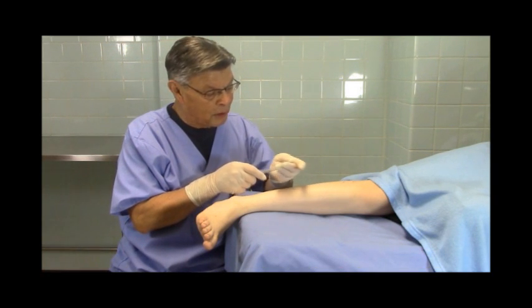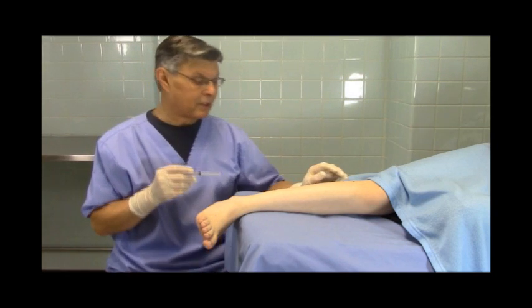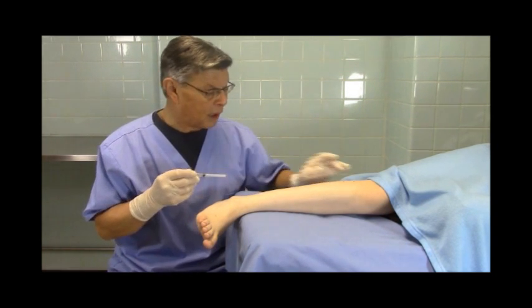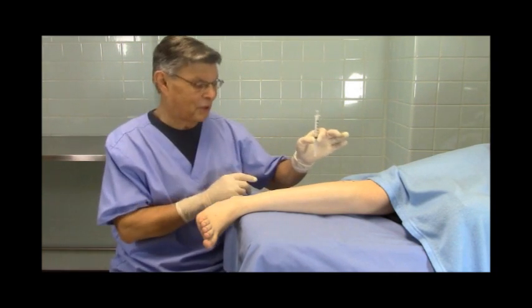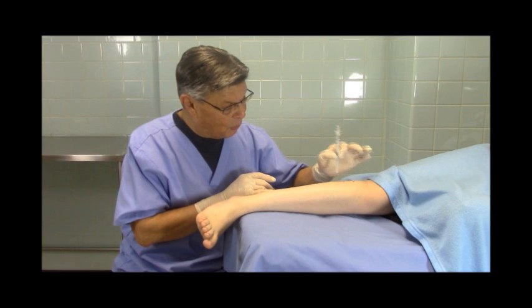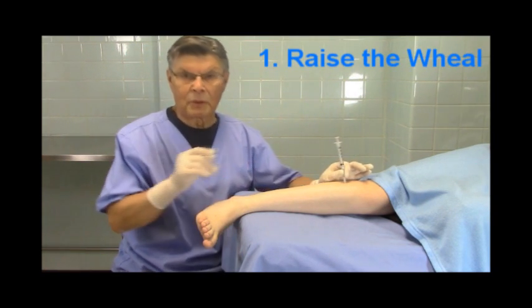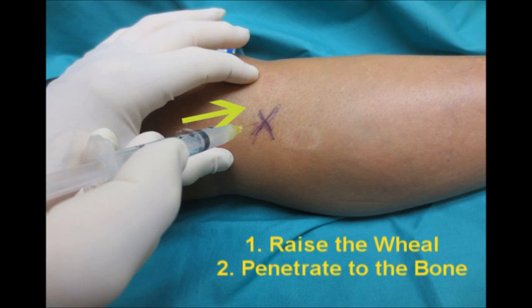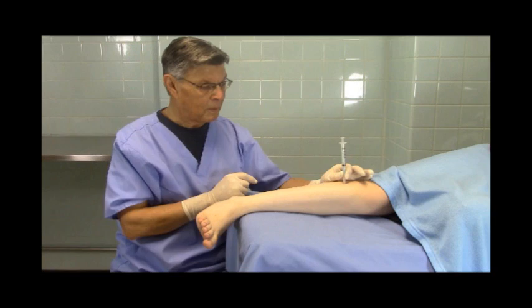I'm not going to inject Lily because I like her too much. Lily, by the way, is one of our podiatric assistants and also the assistant to our administrator, Susie Castro. Once you have the mark, you raise a wheal — you could spray something cold first — raise the wheal, and then you penetrate all the way down until you hit bone. On Lily, that would be maybe about this much before you hit bone.